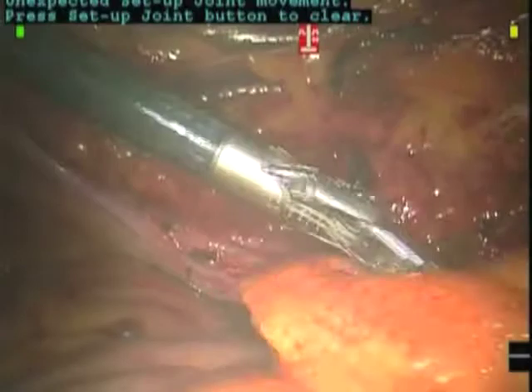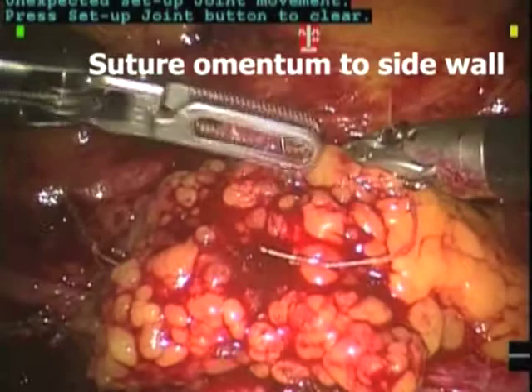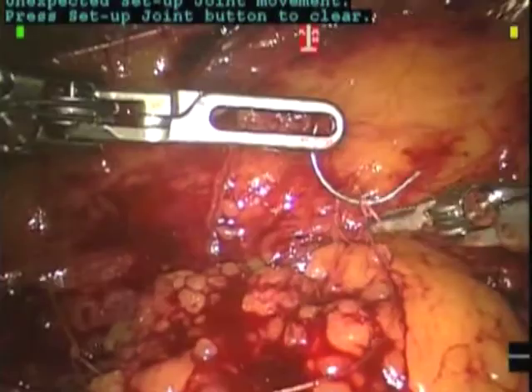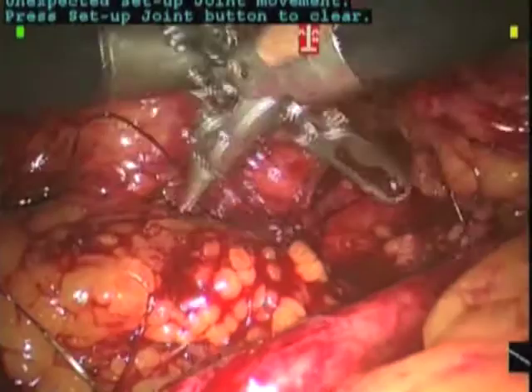We pass the omentum underneath the ureter. The lateral aspect of this flap is secured to the sidewall with interrupted 3-0 suture. We perform this fixation of the omentum distally all the way to proximally. Here you see us fixing the omentum into the psoas muscle lying posterior to the kidney.